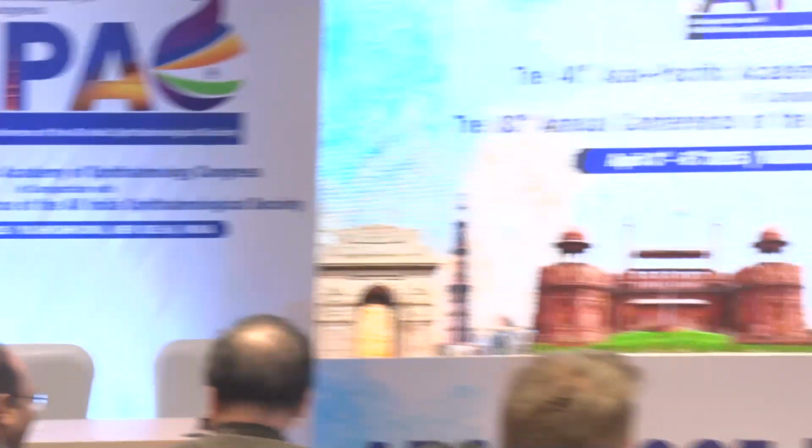I have a quick question about the study of the non-perfused areas: have you taken pericyte loss into consideration while calculating it? No, I will tell you OCTA by itself is extremely difficult. To assess pericytes, we are still far off from that. Adaptive optics work, like what Amani Fawzi is doing, I think they are able to see the pericytes. It should be very, very specialized imaging. Thank you. Thanks a lot.